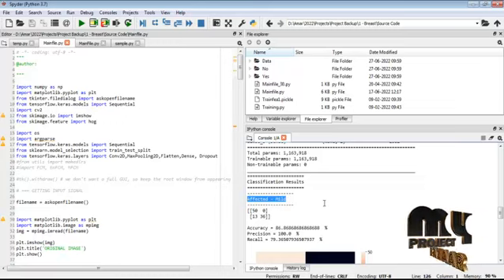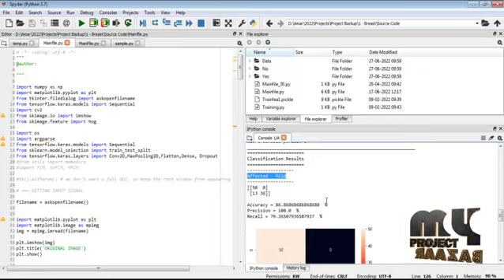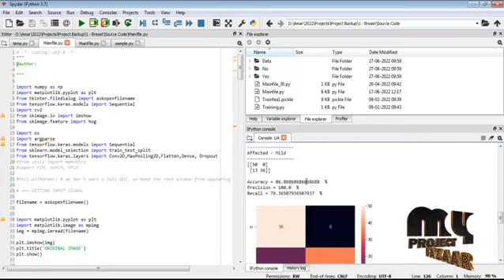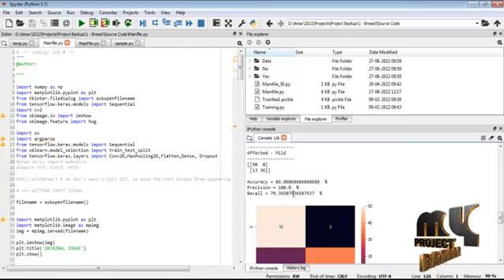After estimating the classifications, we move on to the performance estimation. In the performance estimation, the first stage is to compute the confusion matrix like this. This is the confusion matrix. It will segregate the performance into true positive, true negative, false positive and false negative, and finally based on this we generate the formulas for accuracy, precision and recall.